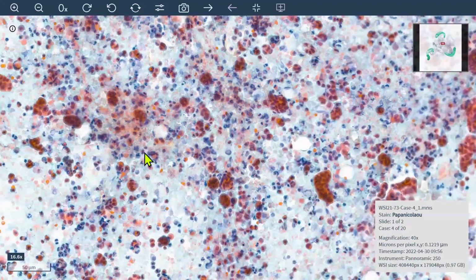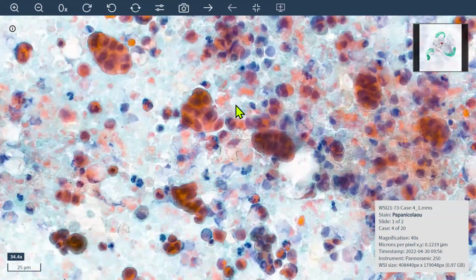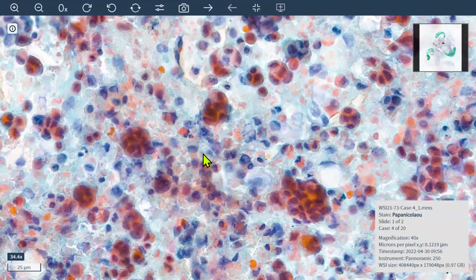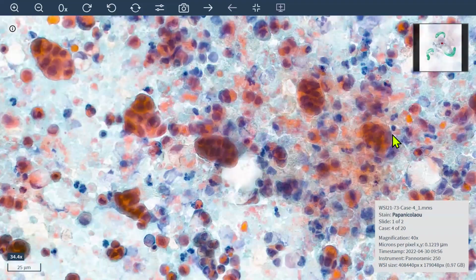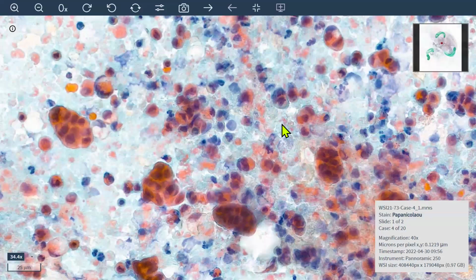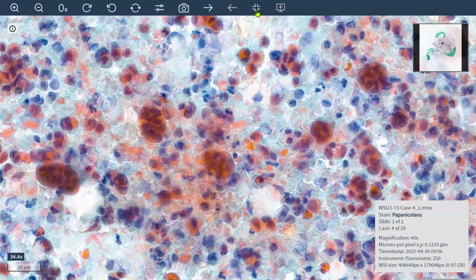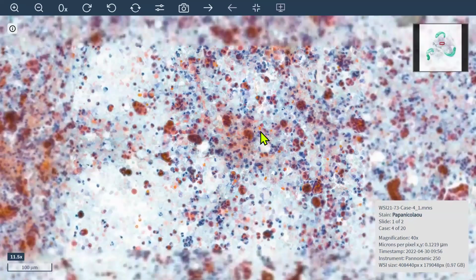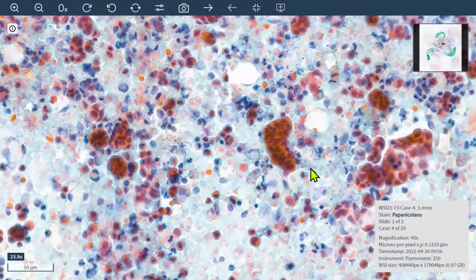How will you put the diagnosis? Are these okay looking cells? Are they low grade or are they high grade? Anyone please? Are these low grade cells or high grade cells? So you have a cyst in the pancreas, high CEA. You know it is a mucinous cyst, and on aspirate you are seeing these cells. Are they low grade or high grade? Answer high grade or low grade in the chat box. No, low grade usually have very scant cellularity. Okay, high grade has this kind of cellularity and these high grade looking nucleus.